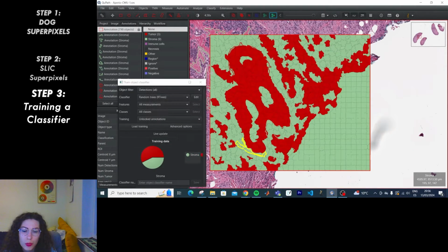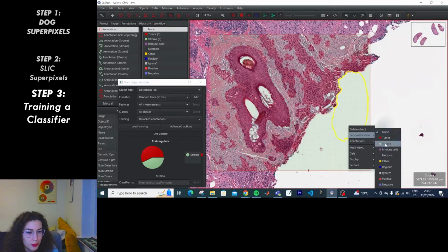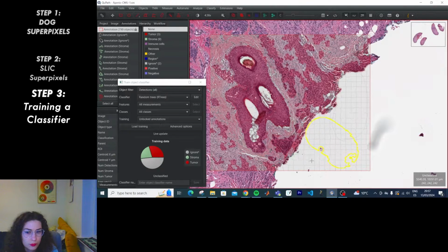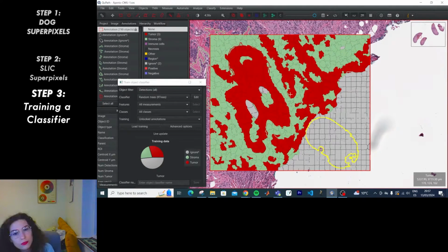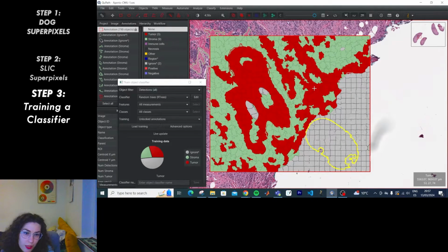What if I remove the map? Ah, I needed that. Okay. I'm missing the ignore class. So there we go. Well, for something like preliminary visualization, I don't think it's such a bad idea to do this. For me, it's more straightforward or logical, or it makes more sense for my brain to see it first like this, have general information, and then do the detailed analysis. This would help me understand the image. But that's just me. If it helps you, use it. If it doesn't, don't use it.